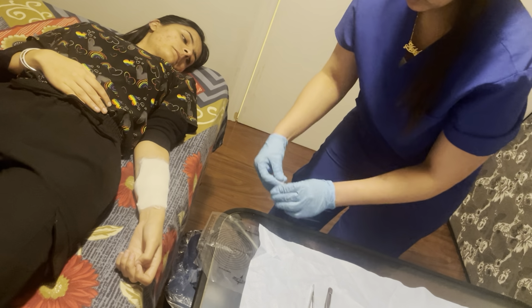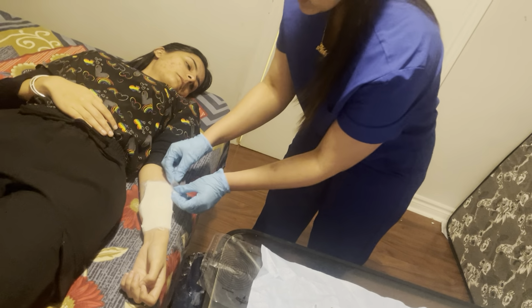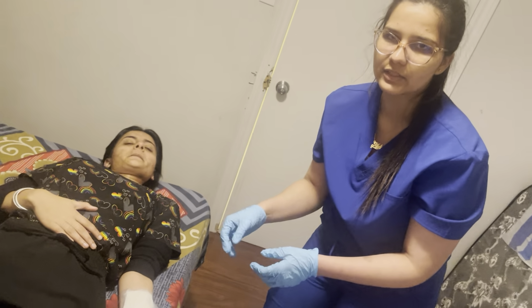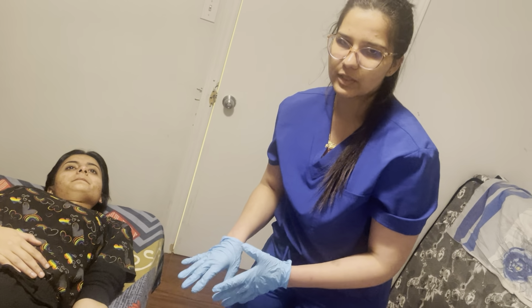So now we are going to secure this dressing by taping it on all the four sides along the border. We are going to have additional tape applied to it, and on this tape I will be writing down my initials and date and time of the procedure when this wound dressing has been performed.